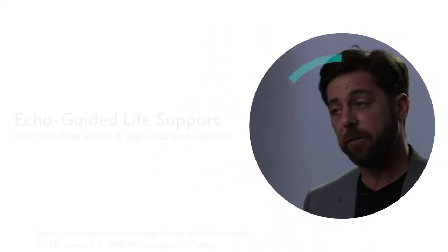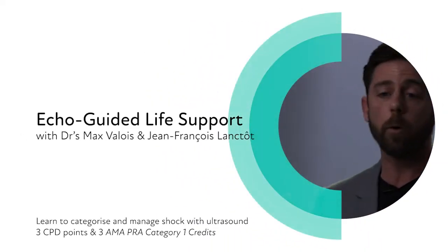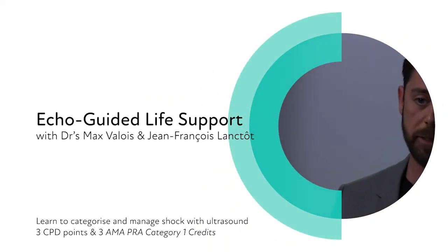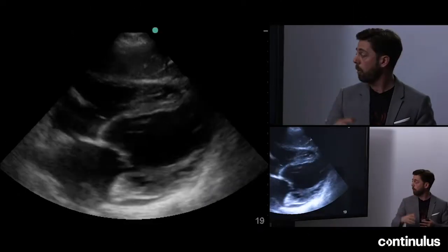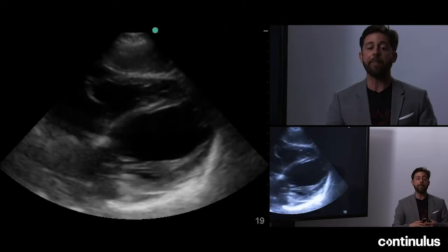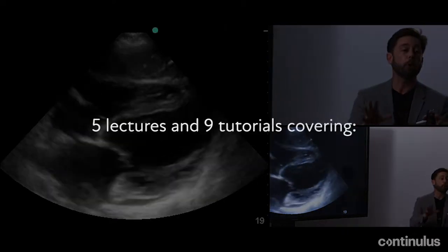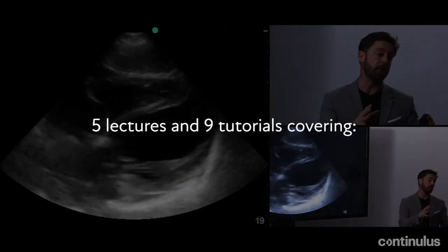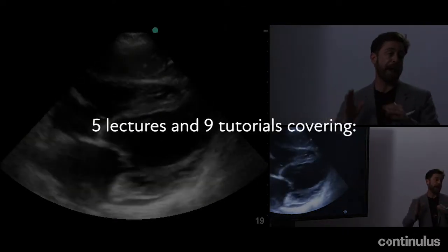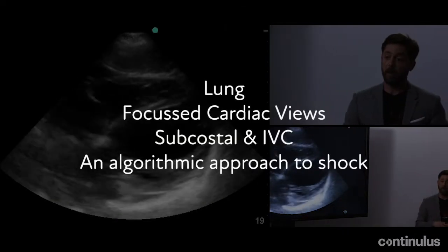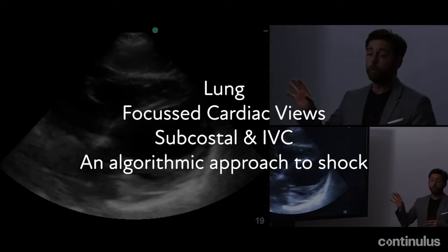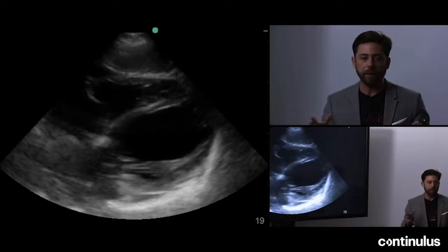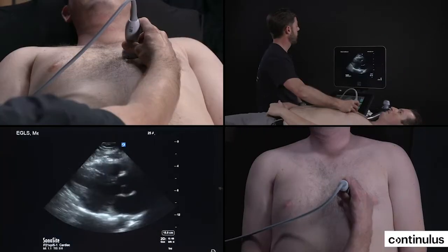If we were to measure the diameter of the cavity here, it would be more than five centimeters from inner wall to inner wall. That means that there's a chronic component to that LV dysfunction. So contrary to the RV, the LV won't dilate acutely.